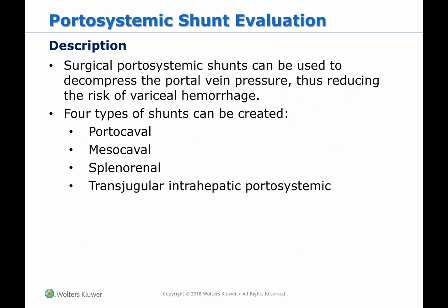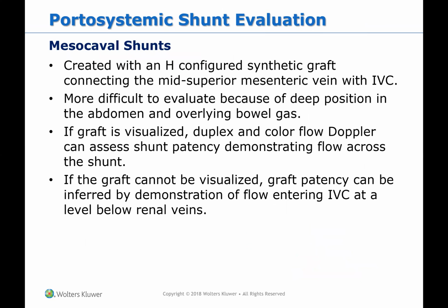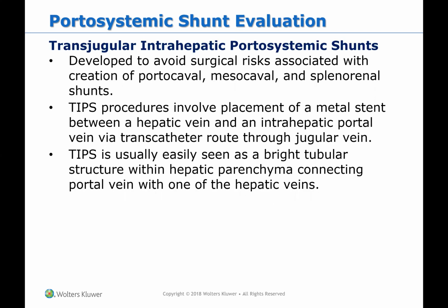For this one, I'm going to talk about TIPS, which is transjugular intrahepatic portosystemic shunts. So shunts help connect something if there's a stenosis or a clot and there's no blood flow. We're going to go in with a shunt and it's going to be like a bridge between the vessels to help get the blood flow going again. One of the ones that I did a lot when I was in the hospital are transjugular intrahepatic portosystemic shunts, or TIPS.